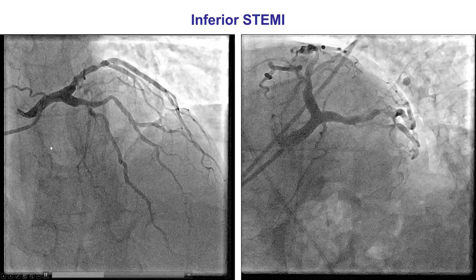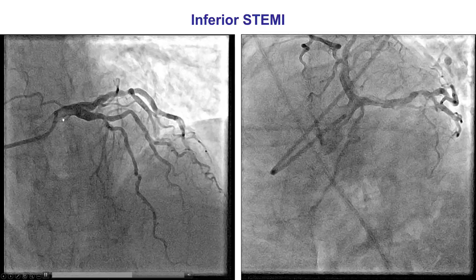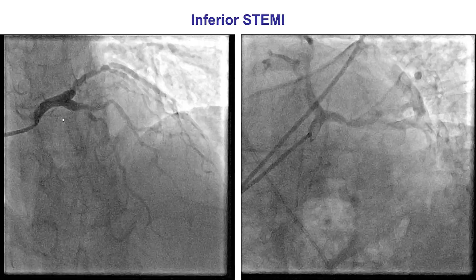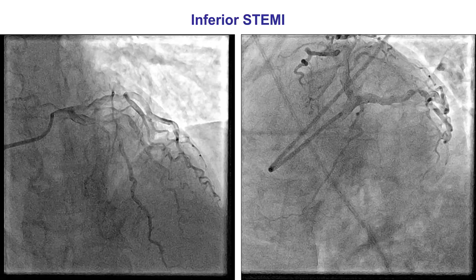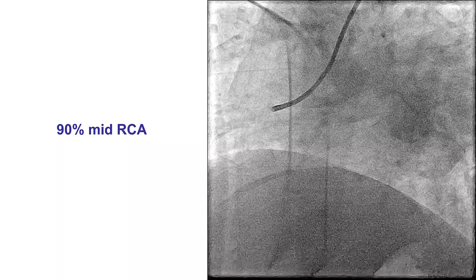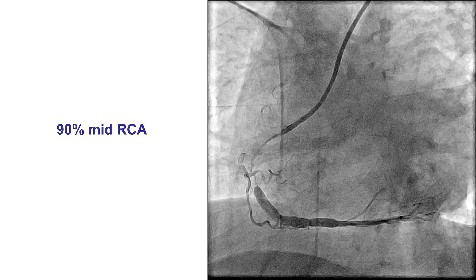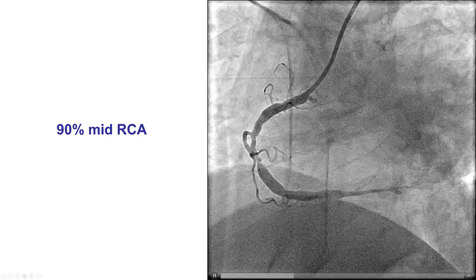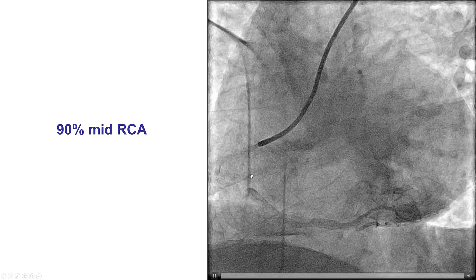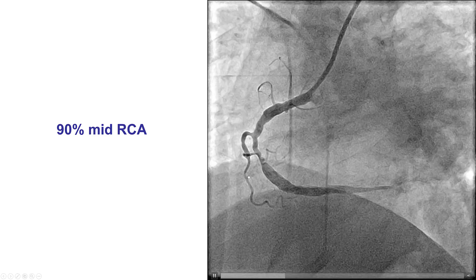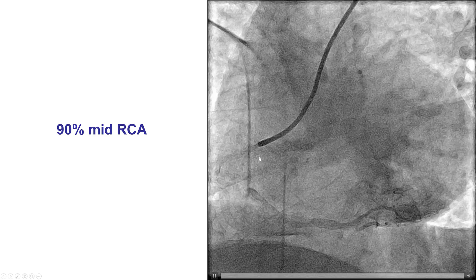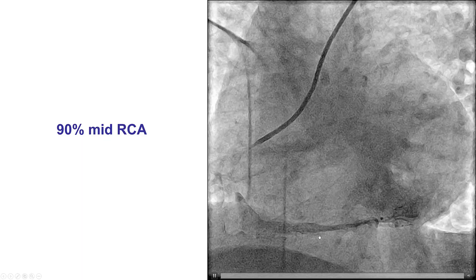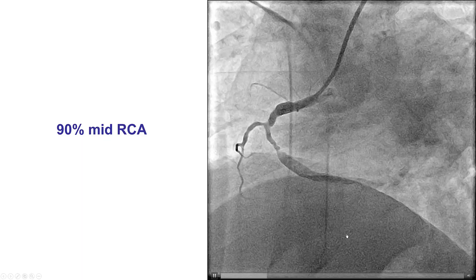In this particular case, we engaged the left main and did not find any culprit lesions, although there was disease in the LAD and the circumflex. On the right coronary artery, there was a significant lesion — a 90-plus percent lesion in the mid-right coronary artery — that appeared to be the culprit lesion, although interestingly, there was TIMI-3 flow at baseline.